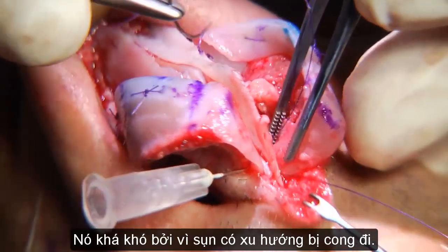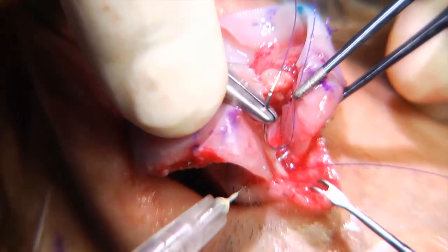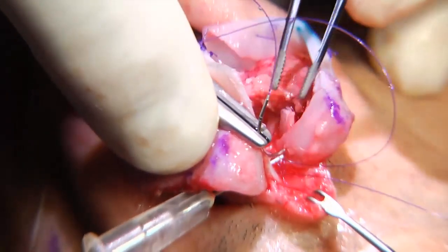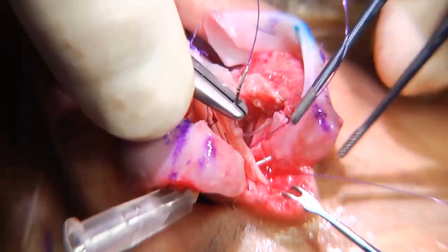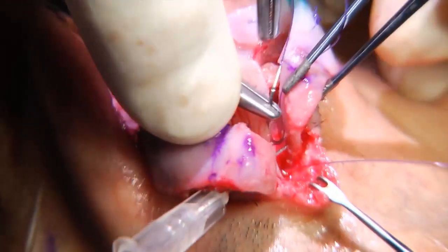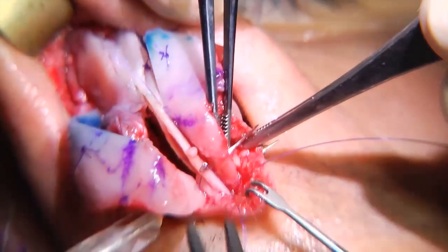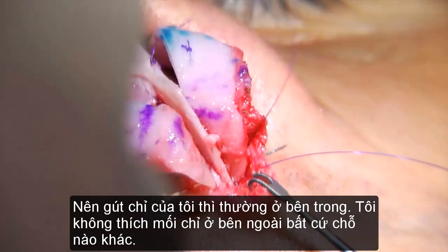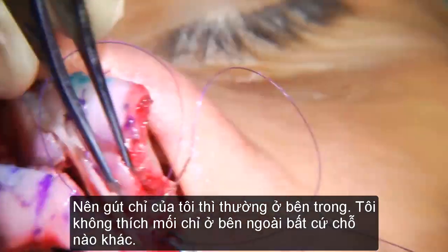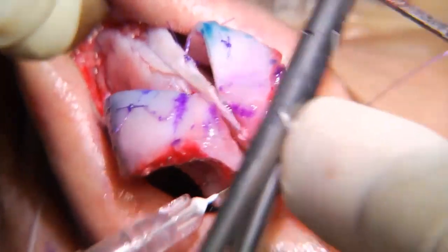So that's tricky because it tends to bend here. So my knots always come in the inside. I don't like having knots elsewhere.